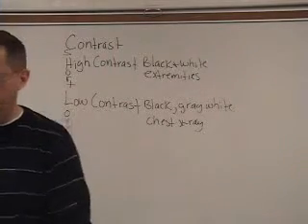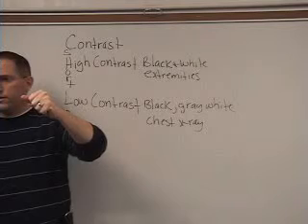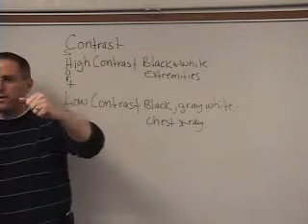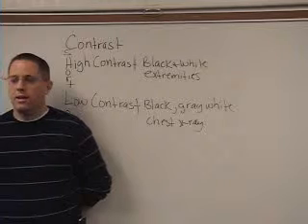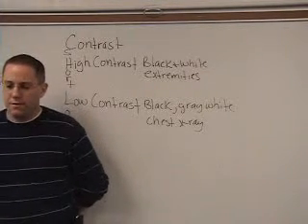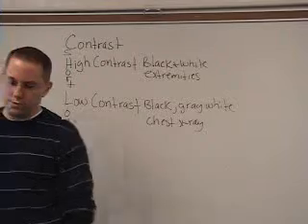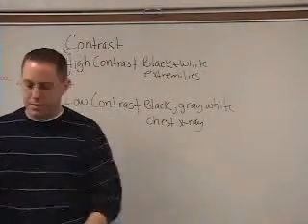Another thing, we've been doing some x-rays this week where you have to turn the x-ray tube. For example, the x-ray of the calcaneus, the dorsoplantar, how much do you angle the x-ray tube? 40 degrees. What about for the foot? 5 degrees. So if you angle it too much, that can also affect the way that the bone looks. That's another thing that affects the geometric property. So making sure you're using the right angle of the x-ray tube is important.